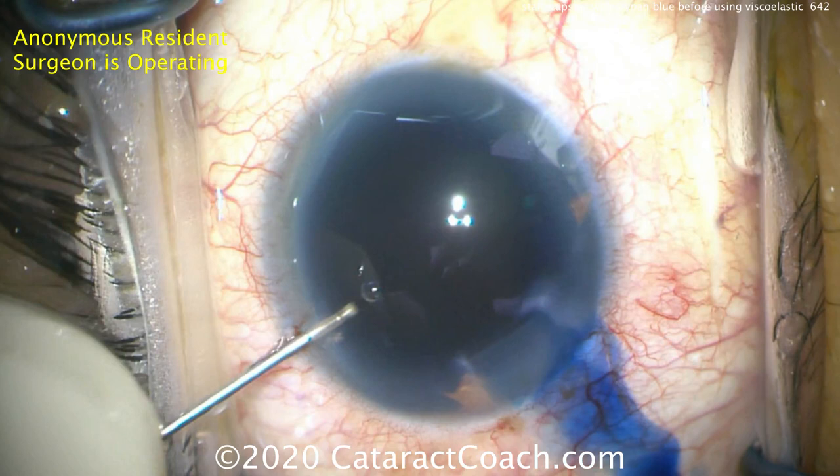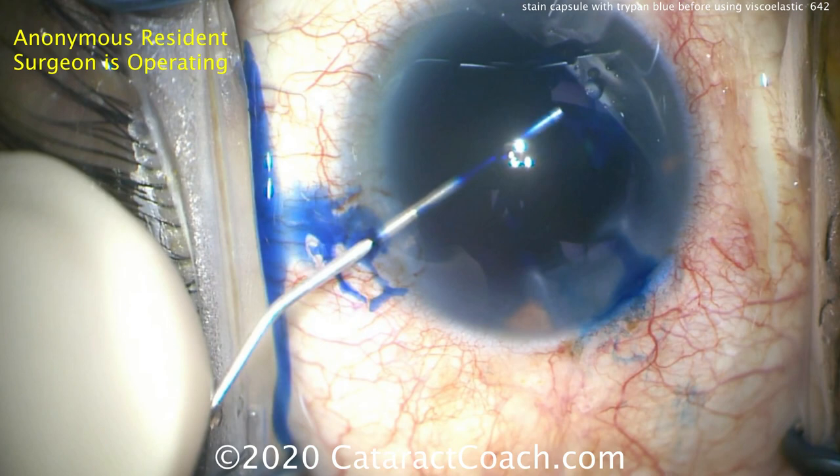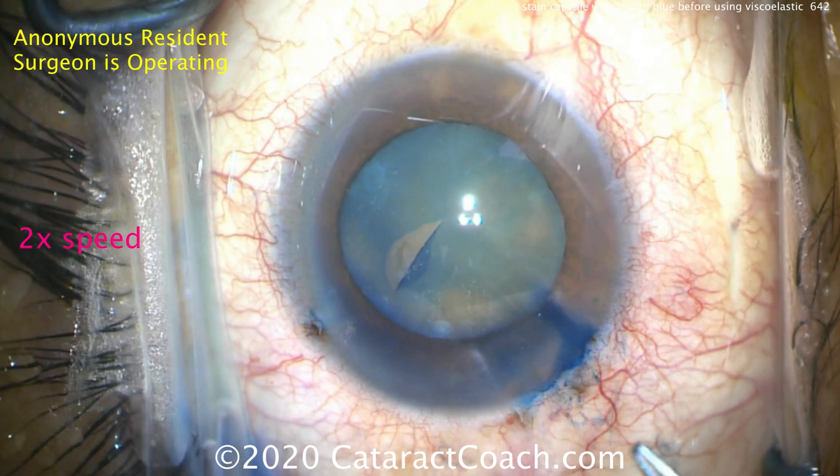You'll also notice that the dye stains the corneal stroma. So even as we wash it out, you'll see the paracentesis and the main incision — the corneal stroma — has been temporarily stained. This dye is temporary and will obviously wash out of the eye. Now ready for the capsulorhexis, and the staining is much better. This will be a lot easier to do.